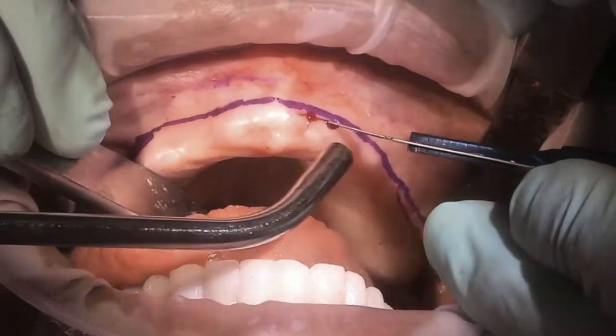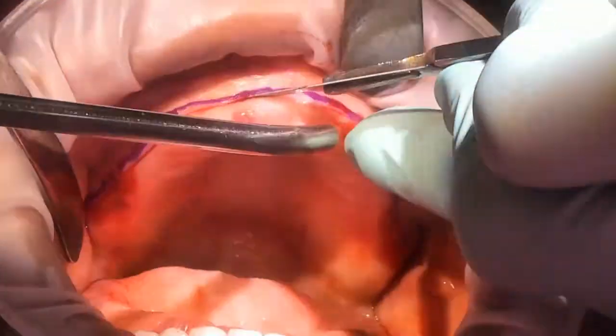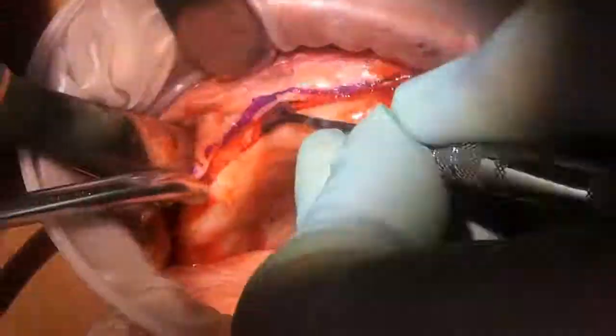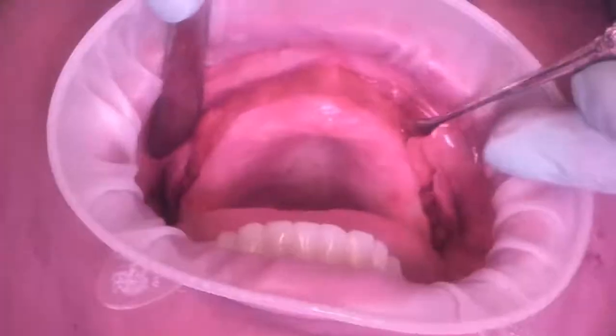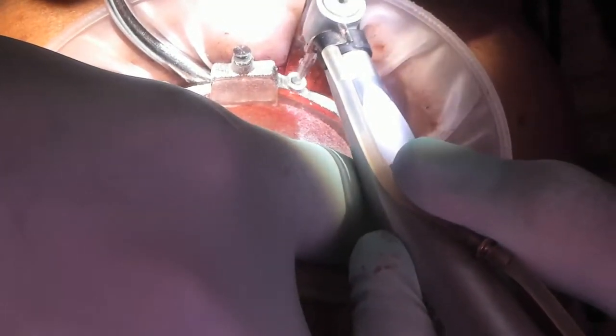A scalpel is used to lay the flap. It's important to note that Dr. Isaac Towle, who is performing this surgery, did not drill the labial sites first. This is a technique that is sometimes chosen, in which the flap is created and then the pin guide is inserted and then the sites are drilled.